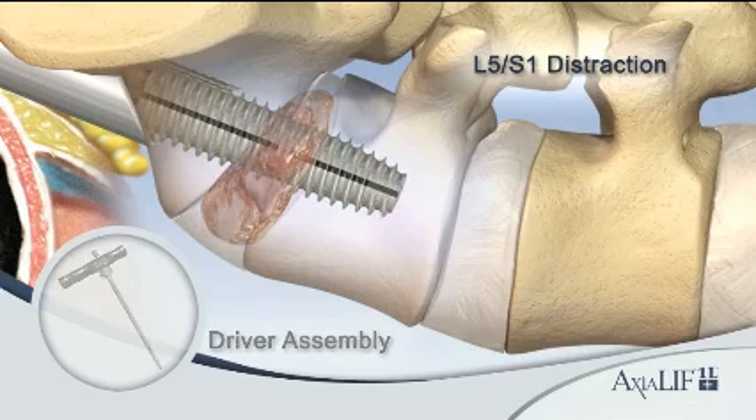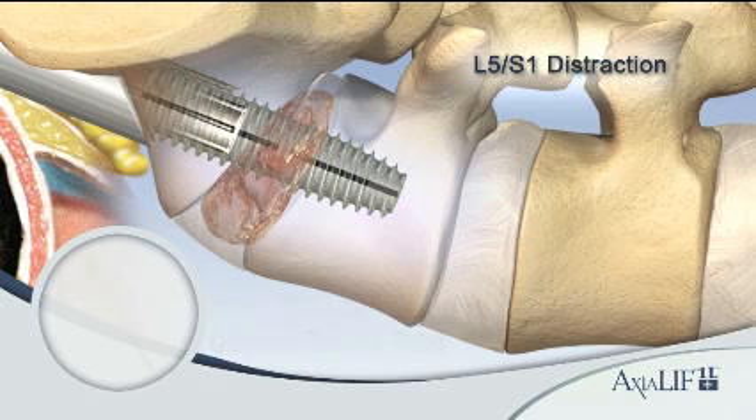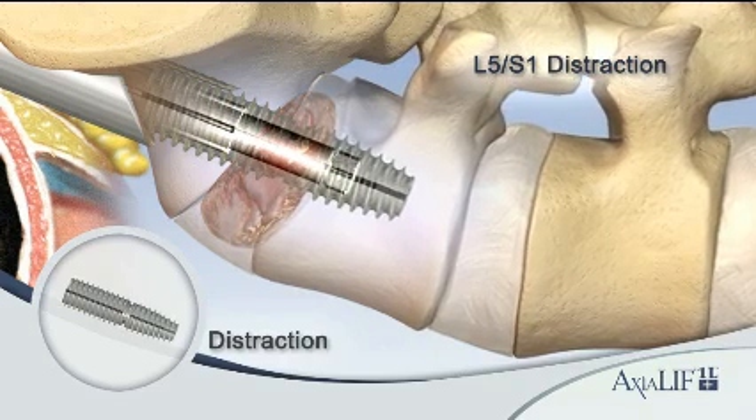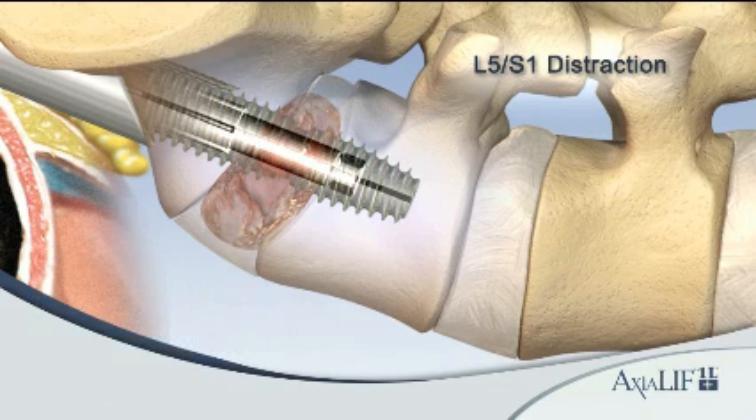Use the counter torque tube and distraction driver to advance the internal distraction rod. They are designed to distract the L5-S1 vertebral bodies, restore disc height, and indirectly decompress the neural foramen. The L5 and S1 anchors remain stationary in the vertebral bodies during the L5-S1 distraction.